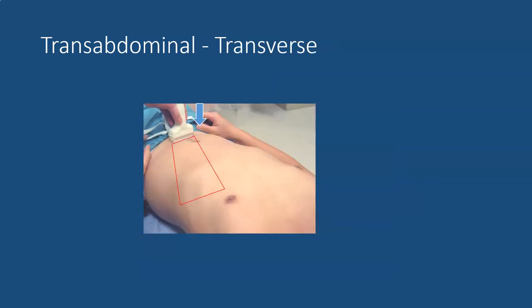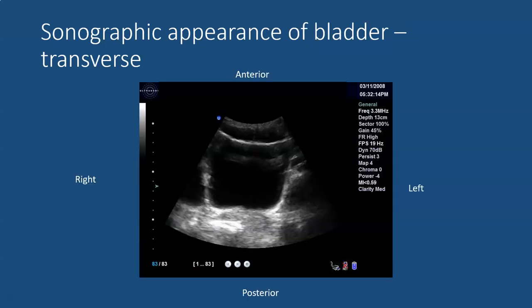After obtaining a long axis view, we'll rotate the probe 90 degrees towards the patient's right such that the indicator is now towards the patient's right. The ultrasound beam will now go into the patient and we'll see our structures in short axis. Again the probe is placed on the abdomen; the top of the monitor is anterior, away from the monitor is posterior. We see the bladder in short axis now looking more square or rectangular. The indicator is towards the patient's right, so this aspect of the screen is the patient's right and the area away from that would be the patient's left.